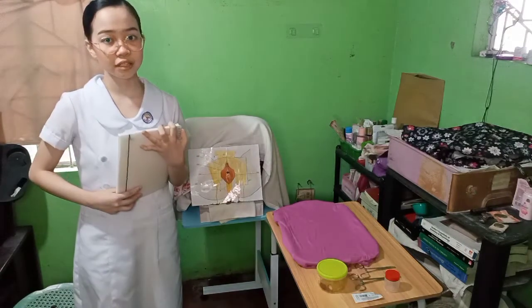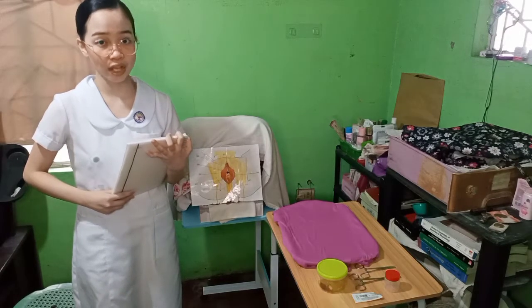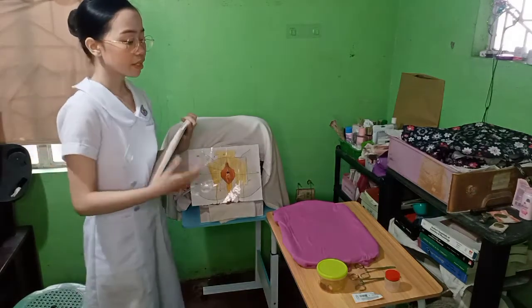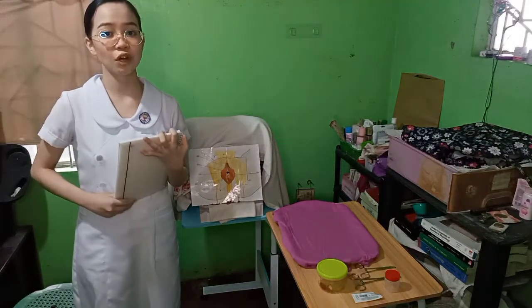Also, we need to record the type and size of catheter that we have used. So we have used a straight catheter French 12. And also, record the type and amount of urine that we have obtained.